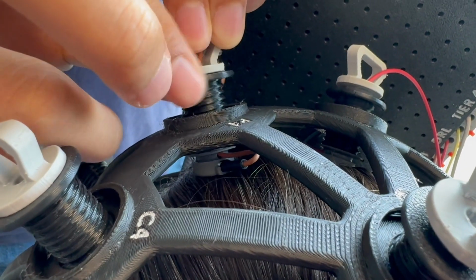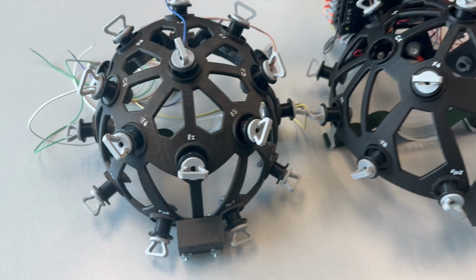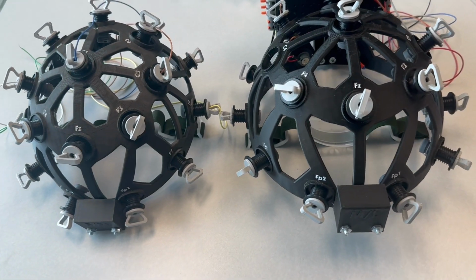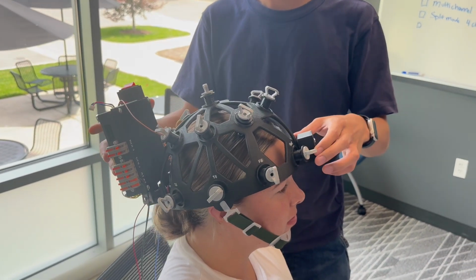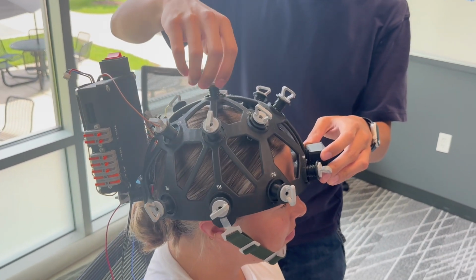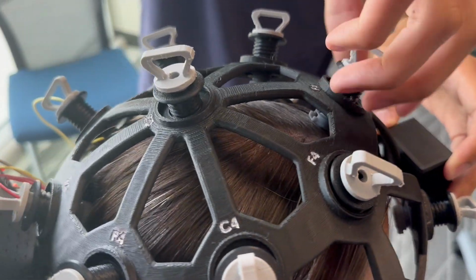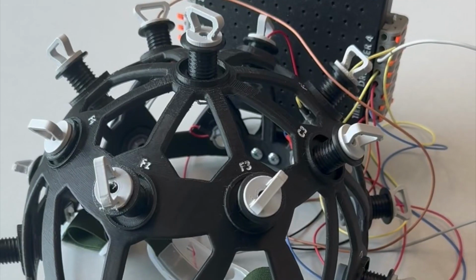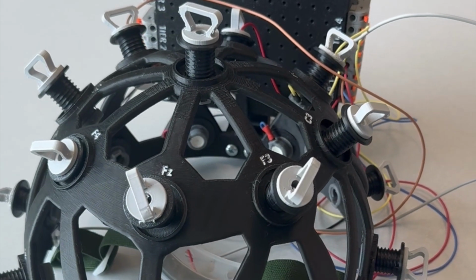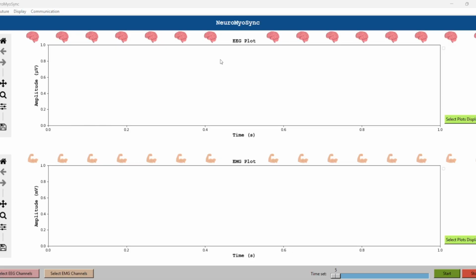The headset is available in 2 size options, small, medium, and medium-large, to accommodate a wide range of head shapes and sizes. Once the electrodes are installed and fully loosened, the user places the helmet on their head. A chin strap and a front-mounted counterweight help stabilize and center the enclosure. All electrode positions follow the standard 10-20 system for EEG signal acquisition and are clearly labeled according to their respective locations. I'm going to walk through some features of our GUI.